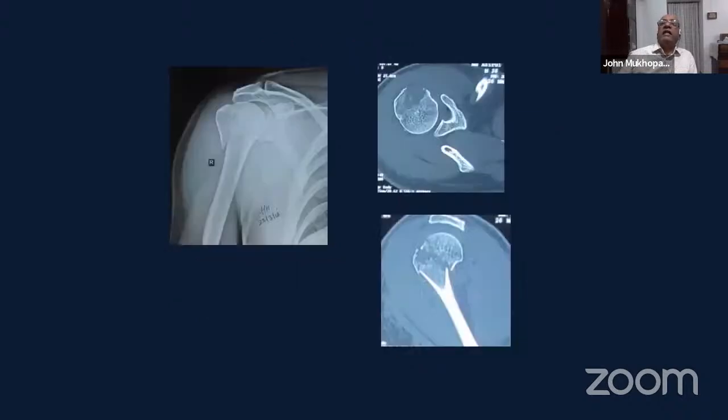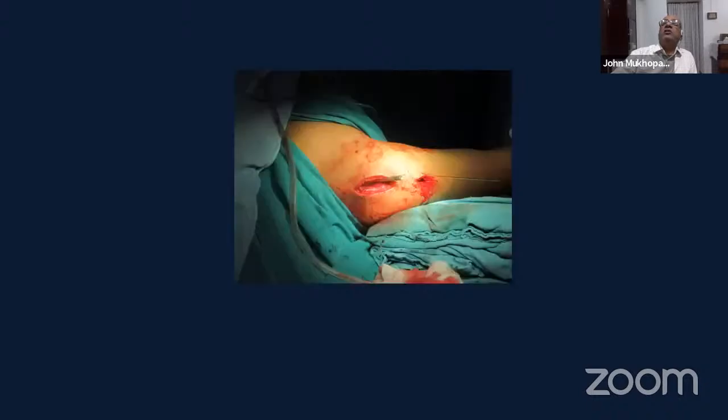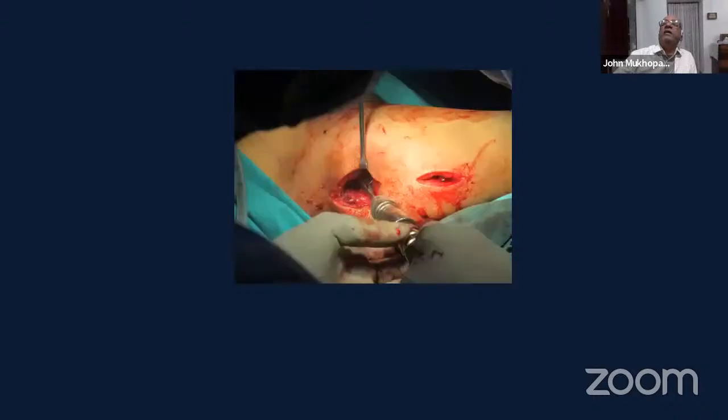So this is the case I showed before where you have a tuberosity fragment and a neck fracture. That's the proximal incision. That's the mark of the distal incision. You slide the plate down. We just have a sleeve on it. You put a wire into the plate distally. Make sure the plate is well situated and then go on to do your fixation.